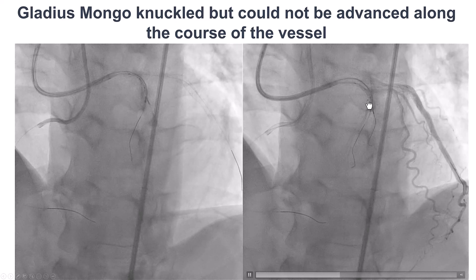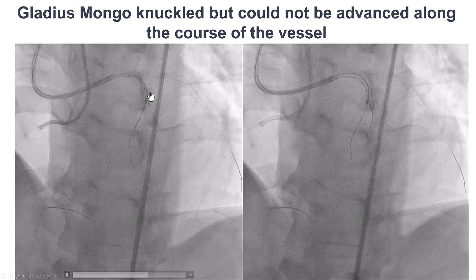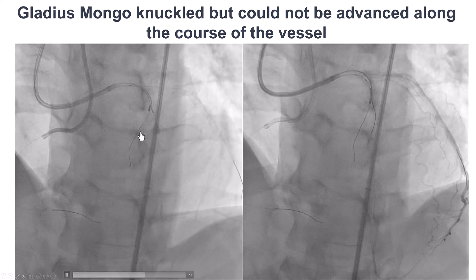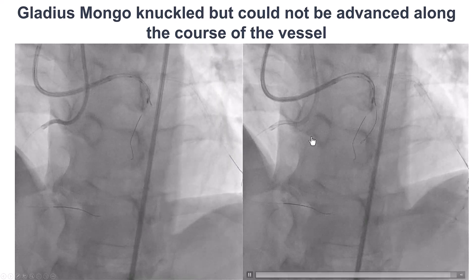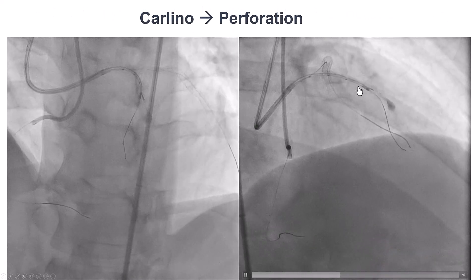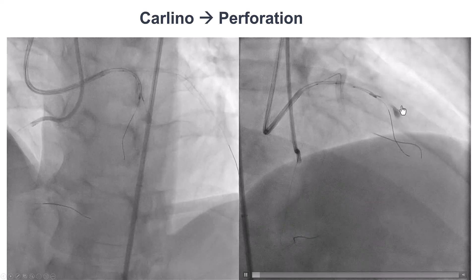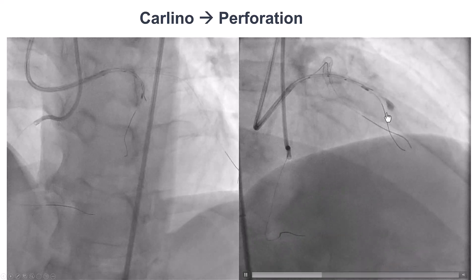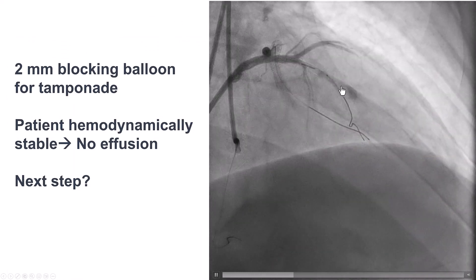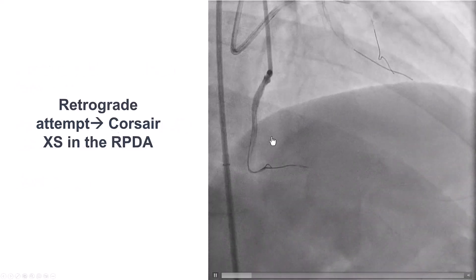We tried to knuckle the wire to advance it, but that didn't work. We then performed the Carlino technique, injecting a small amount of contrast through the microcatheter. We observed some staining, which looked like a perforation. We decided to occlude this with a small balloon. The contrast was not rapidly dissipating, suggesting this may be a contained dissection. The patient was doing fine, an echo was performed, and there was no effusion.